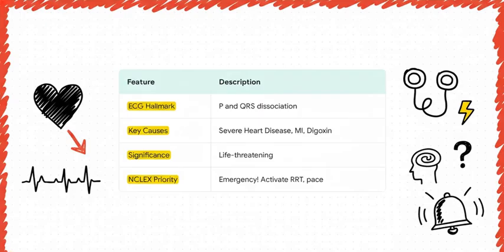The ventricles are beating so incredibly slowly, we're talking often under 40 beats per minute, that cardiac output just plummets. Your patient is almost certainly going to have symptoms like dizziness, confusion, or severe hypotension. Your immediate priority, without hesitation, is to call a rapid response and get those pacer pads on.